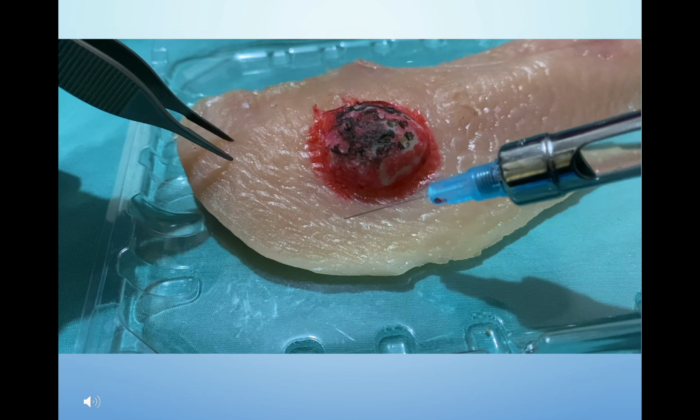An elliptical incision was made, although it doesn't look as perfect as the 3:1 ratio of length to width. The growth is included, the reddish area is also included, and some of the normal mucosa.